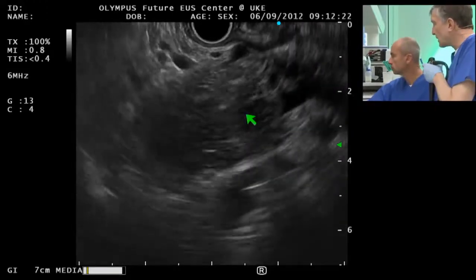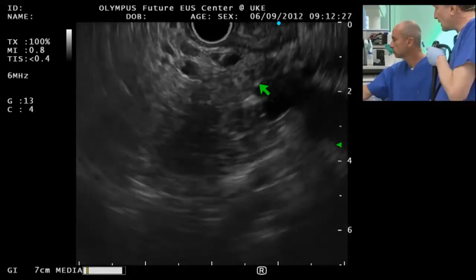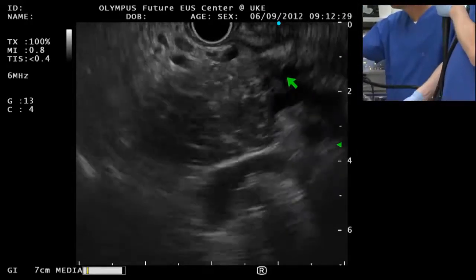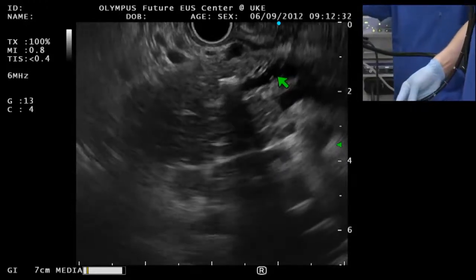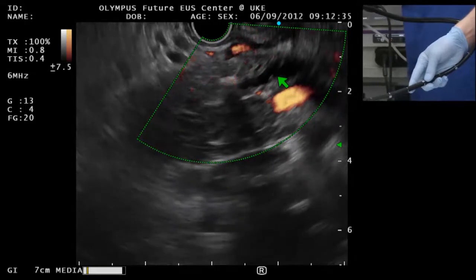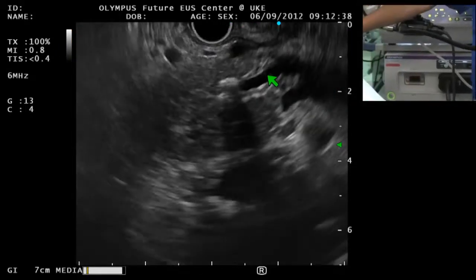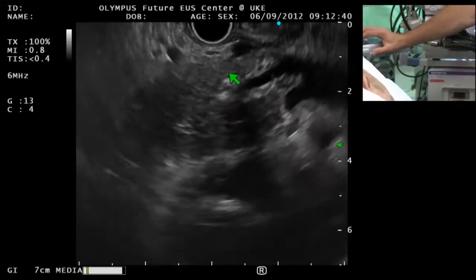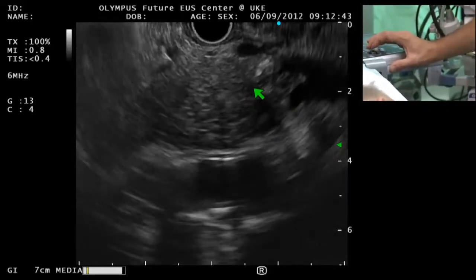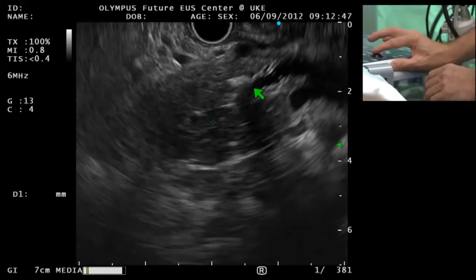So I slip back a little bit. And here's the dilated duct. I rotate. Here's the dilated duct. Behind the stricture, and very clearly we see a stone. So when I did radial EUS there was a calcification at the duct, obstructing the duct.